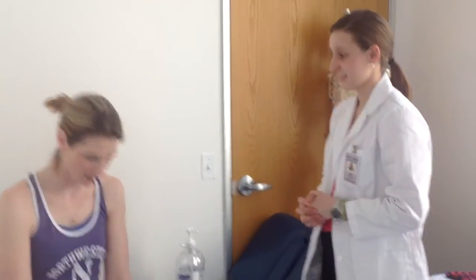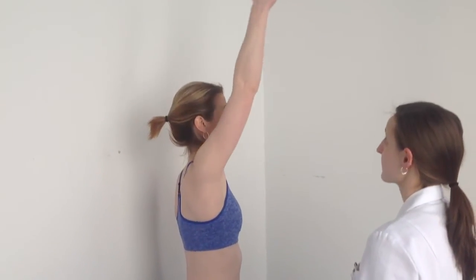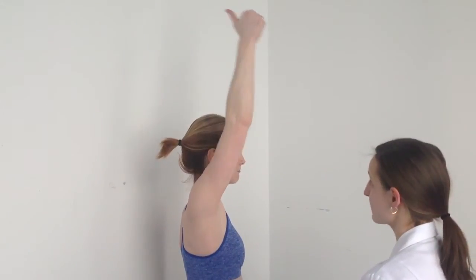All right, so if I could just have you stand up and take off your shirt. Okay, so you can turn towards you a little bit. Perfect. Callie's visually confirming that Tracy can zero. Okay, so now I just want you to do that motion for me that we just described. Okay, so thumb to the ceiling. Perfect. All right, and come back down. Looks great. Okay, so I'm just going to find a landmark for taking the measurement, okay?